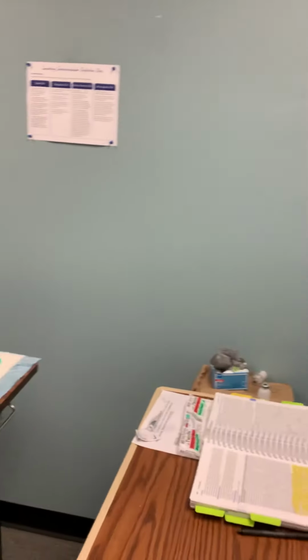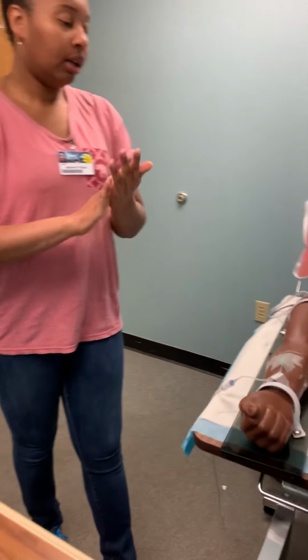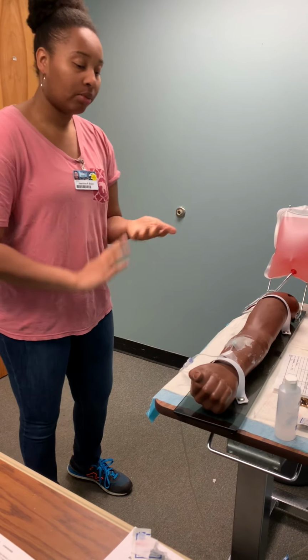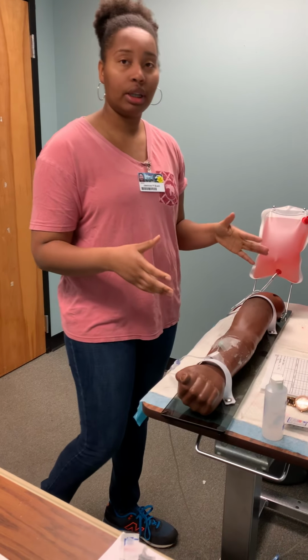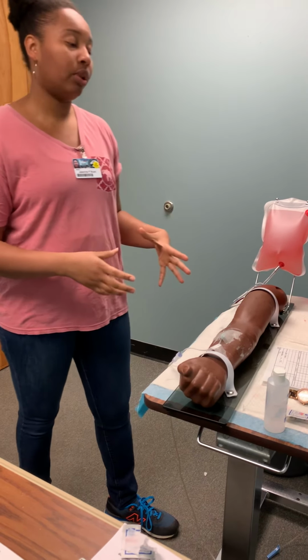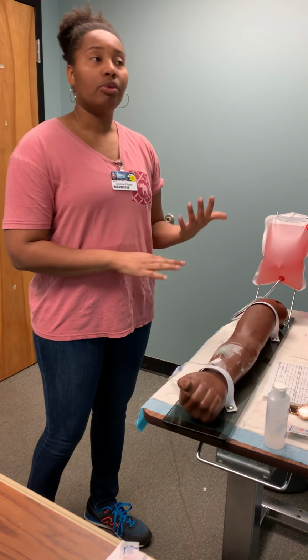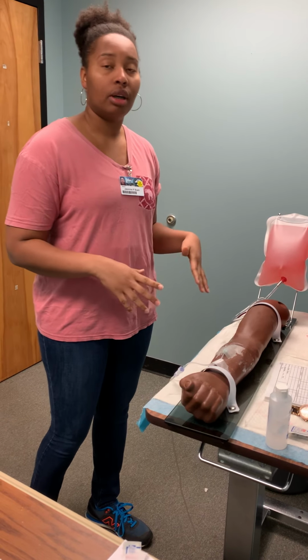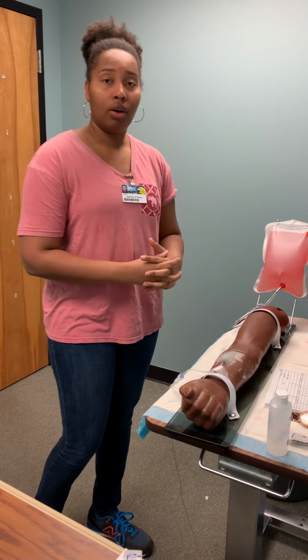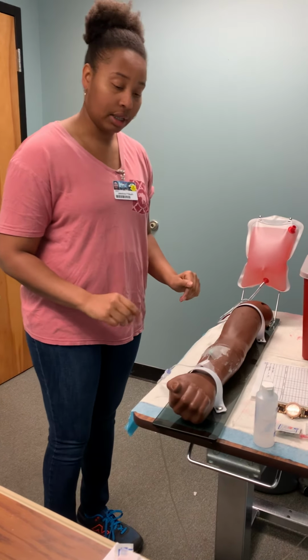I'll wash my hands. I'll assess her site, but first, before I assess her site, I'll give her education. You will be receiving furosemide because the doctor ordered it, and he said that you have too much fluid in your lower extremities. So this furosemide will pull it off. It will also lower your blood pressure because you'll be going to the restroom. So when you get up, try to call us so you don't fall. Make sure you have your skid-free socks on and the bed in its lowest position.